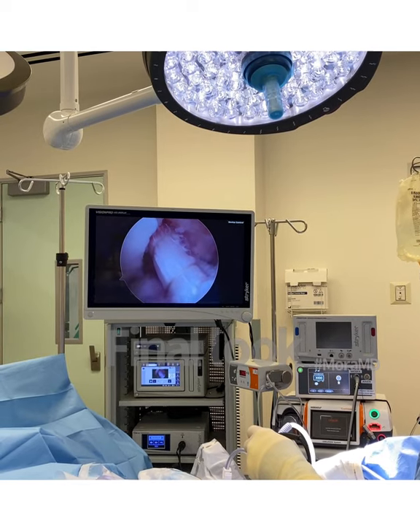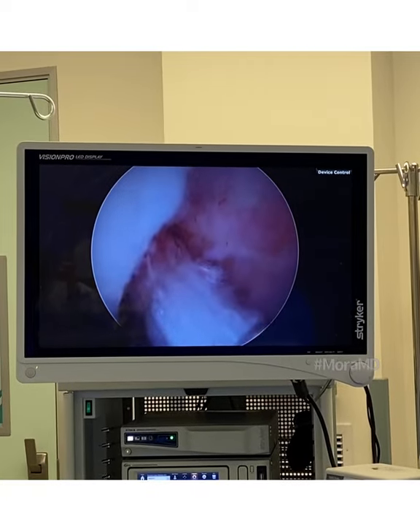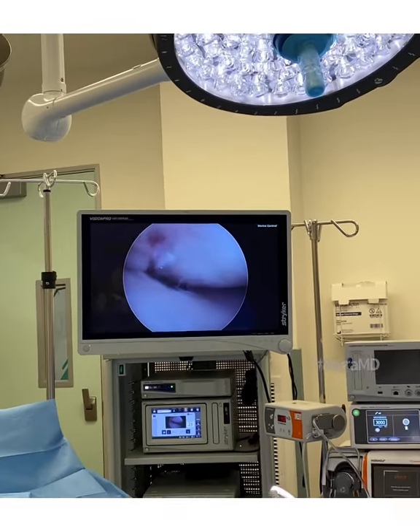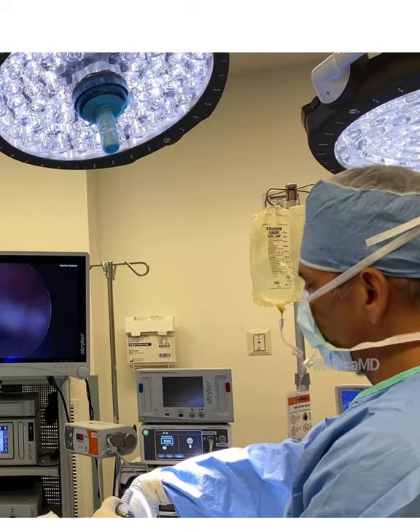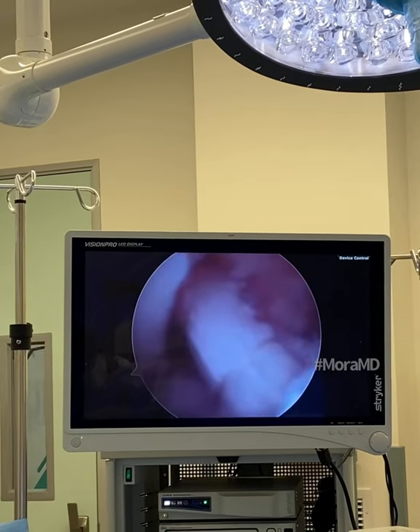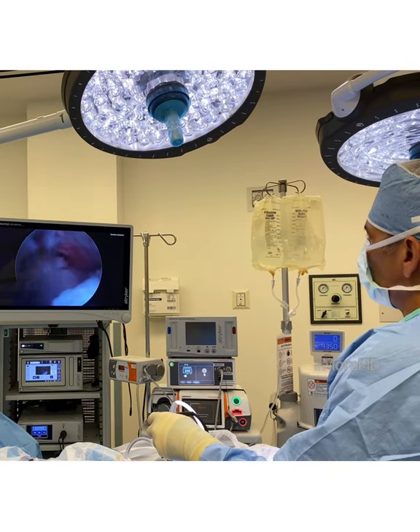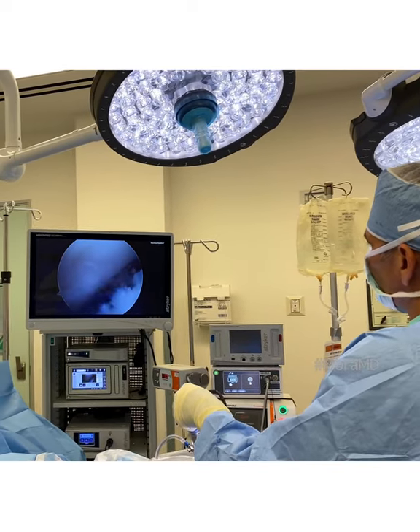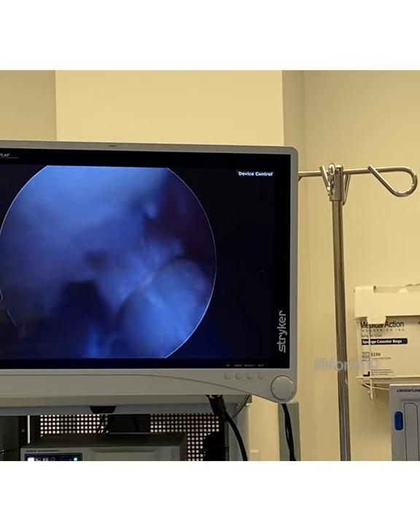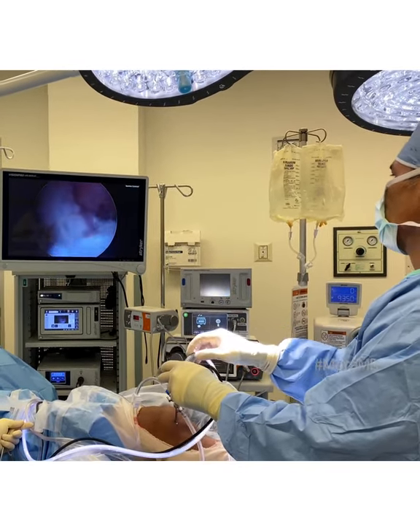I'll now show you the final ACL allograft. There it is — ACL allograft fixated in the femur with the screw, fixated in the tibia, right in the middle of the natural ACL footprint. And then I did a medial meniscus repair — a very common type of case in fighters and athletes. The last final check of this surgery is to make sure there's no impingement. I did not take any bone off this notch — full extension, zero impingement, and full flexion with no issues. Just wanted to show you the importance of tunnel position to avoid impingement.